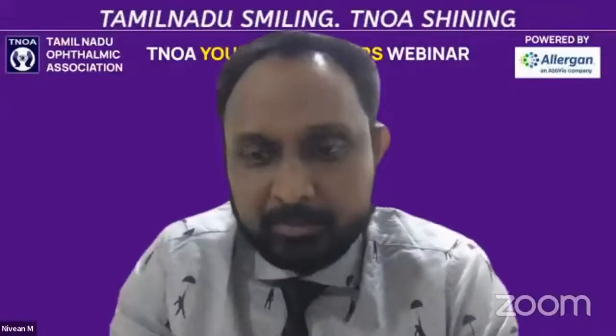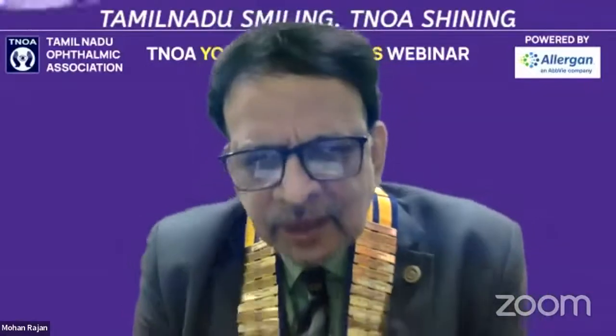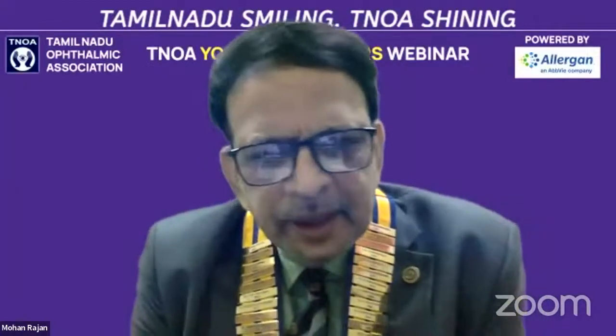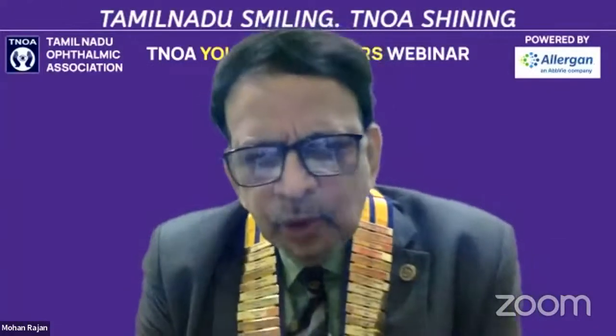Yes, sir. I think for all glued IOLs, SF IOLs, the bag, the cortical remnants, everything has to be cleared up. Do the anterior vitrectomy, use triamcinolone for that, and make sure that the entire pupillary area and also the sulcus area is completely clear before you insert these lenses.